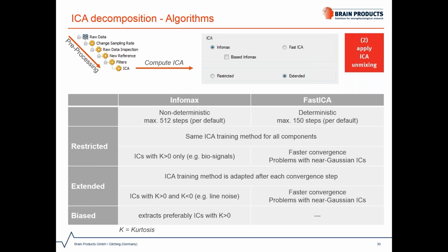Or let's say you run it on the same data set on 2 computers. So it might be very similar, but it is not 100% the same probably. Fast ICA, however, is deterministic because it uses a fixed point iteration, and every run will deliver the same results.